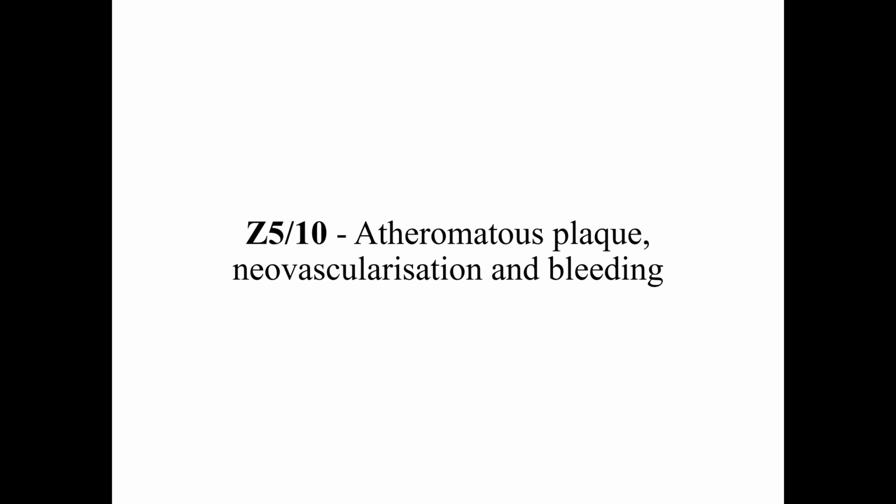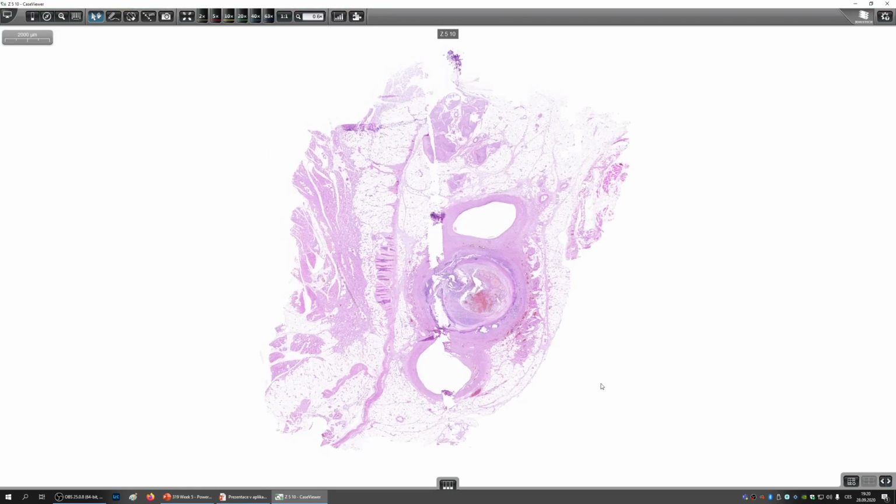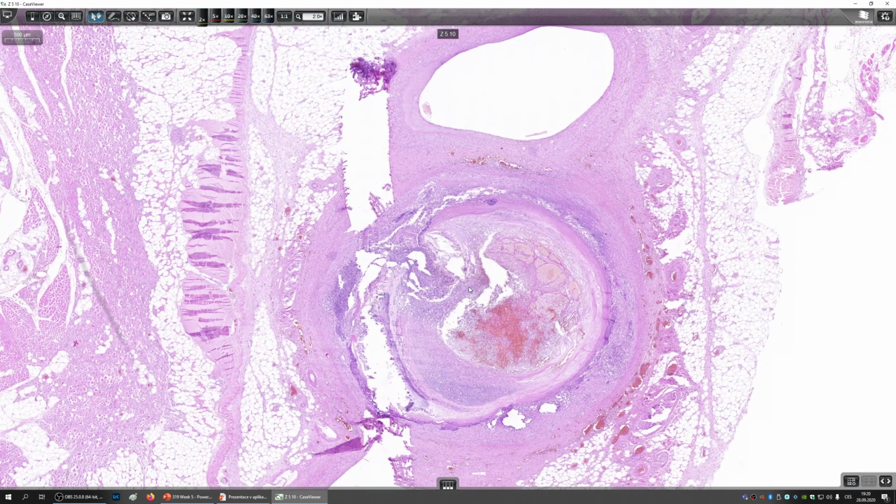That is extremely important, and so on. So multiple organs can be affected. So atherosclerosis is essentially a systemic disease. So let's check out some plaque morphology, because some plaques are more dangerous than others. As I've already mentioned, the small plaques, the fatty streaks and fibrous plaques, are essentially harmless. The dangerous ones are plaques which are calcified and which contain a lot of fat.